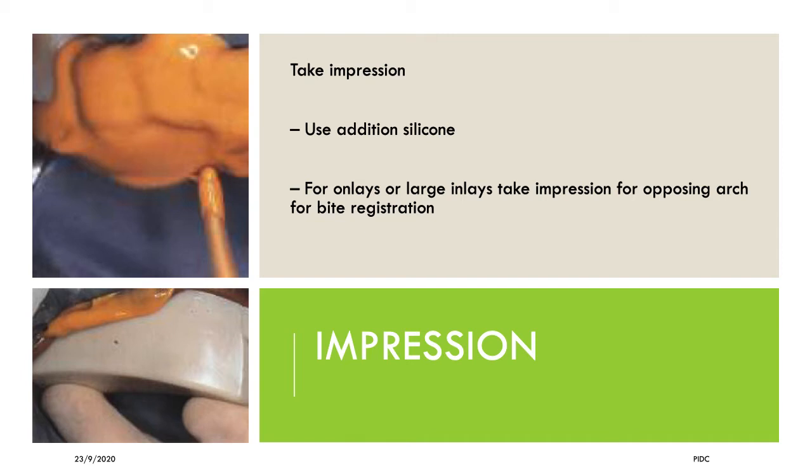Thereby you complete the sequence of recording that prepared tooth, and at the same time you can visualize the recorded tooth surface on the computer screen. We spoke about this in CAD-CAM. Make sure the prepared tooth is completely recorded on the computer screen. Once it is done, you can stop the digital impression taking and go ahead with the shade selection.